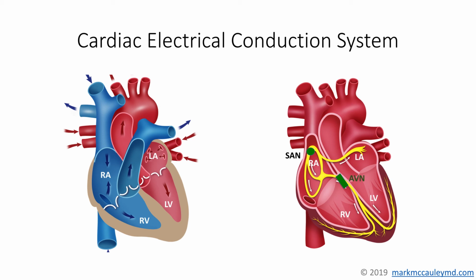So finally, electrical repolarization in the atria and ventricles occurs in diastole, and this repolarization prepares the heart for the next electrical impulse. The most important point of this slide is that in the normal heart, there's an orderly progression of depolarization from the sinoatrial node through the atria, through the AV node, and then to the His-Purkinje system, and finally to the ventricles. And then after this depolarization occurs, then there's a diastolic resetting and repolarization of the heart. These events are easily seen and measured on the ECG, and these concepts are important for understanding cardiac function.